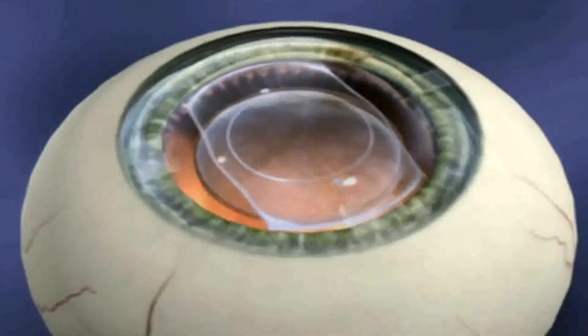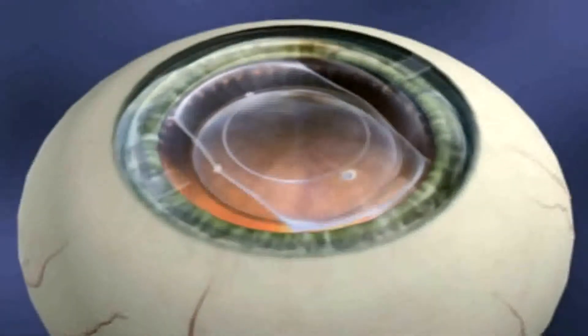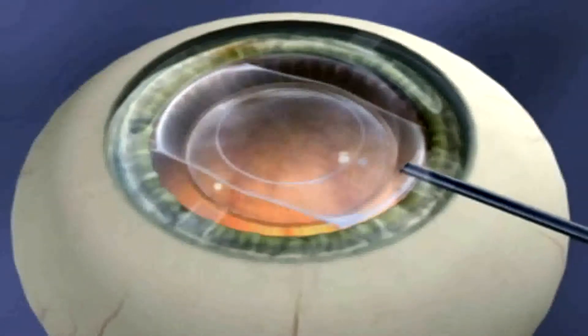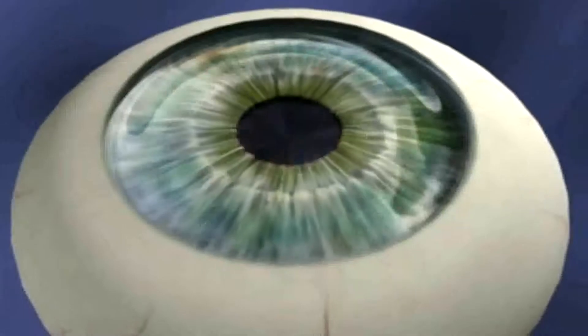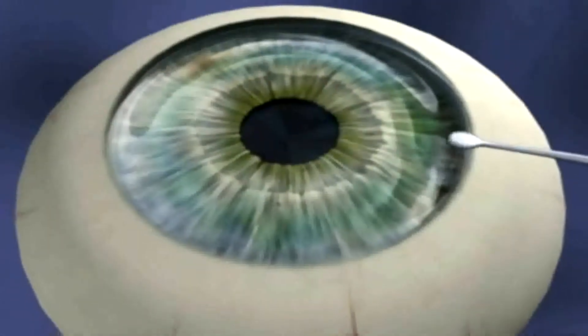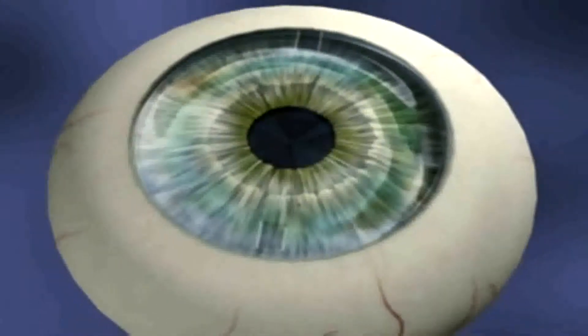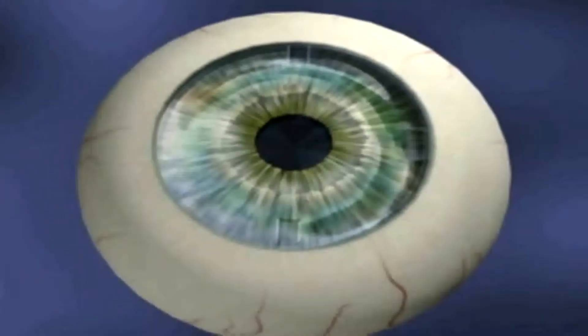After confirming that the footplates are behind the iris and that all the viscoelastic has been removed, constrict the pupil with Miochol. Test the wound to confirm a self-sealing closure. Following surgery, apply a topical antibiotic, anti-inflammatory, and steroid.